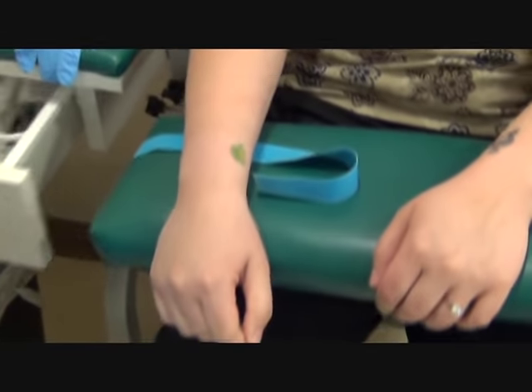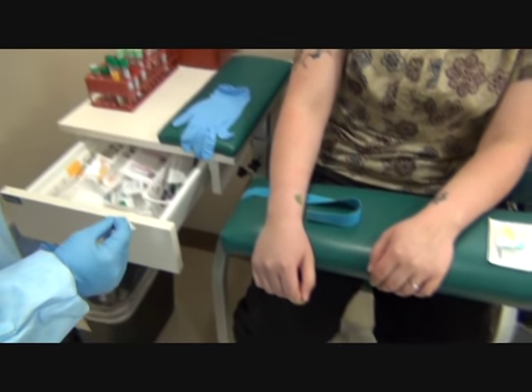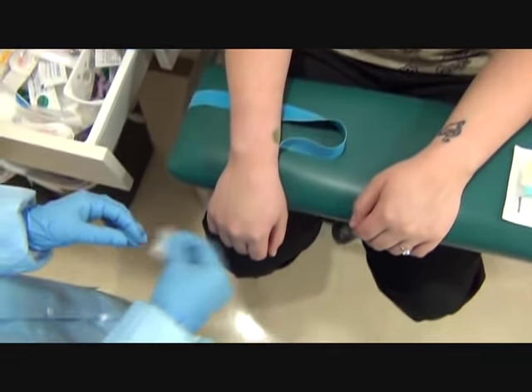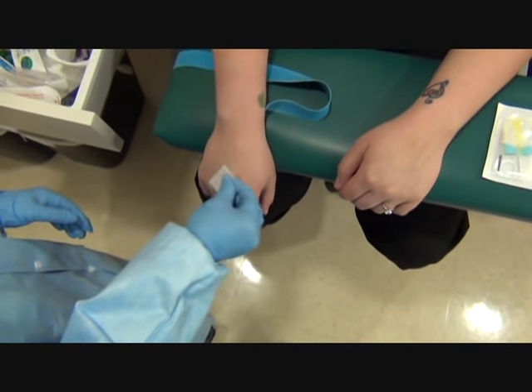Go ahead and open up your hand. I'm going to clean the site. Wipe down once. Flip over the alcohol — counter clockwise, concentric circles, moving outward.